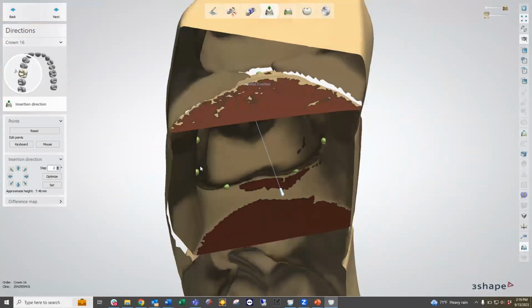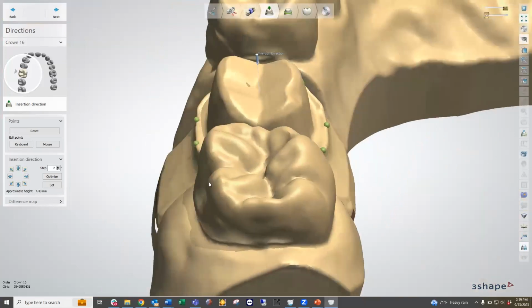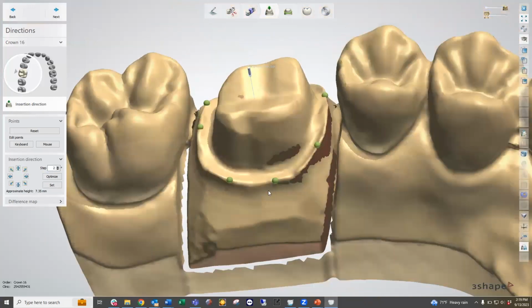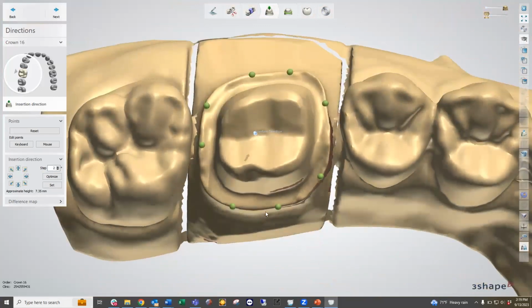But now, since I've changed my view, if I select that bottom arrow, it's going to bring it more distally. So these arrows only work relative to your current view session and are really dictating the location based upon your current view. If I wanted this to be more centralized along the top, I could use these arrows to show exactly where we're going by looking at where the arrow is presenting in our current view.